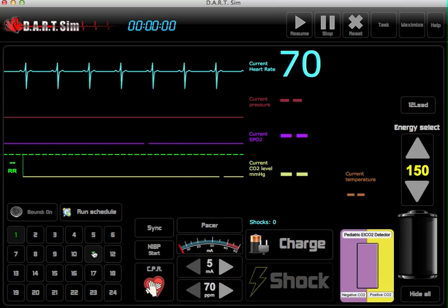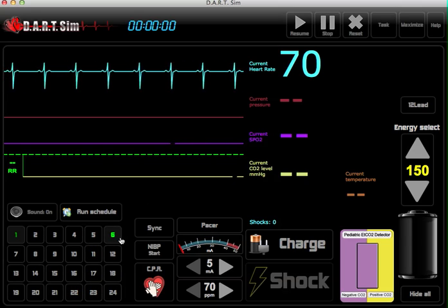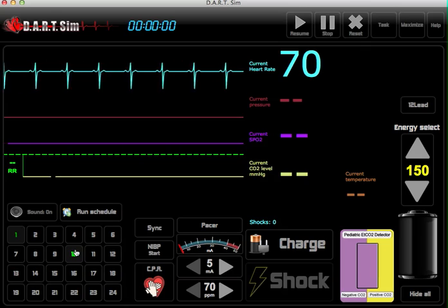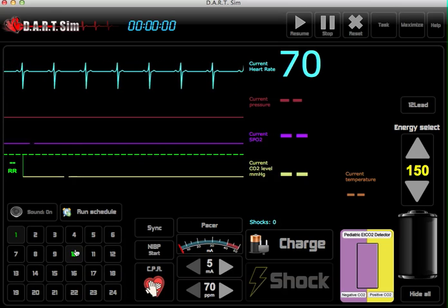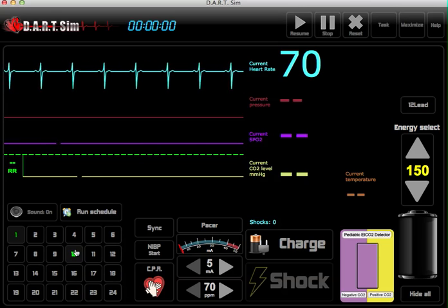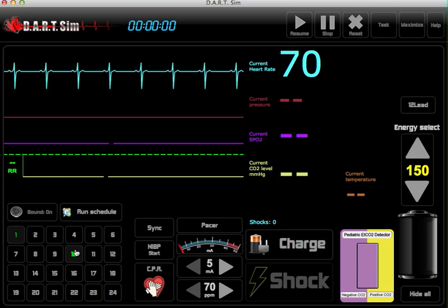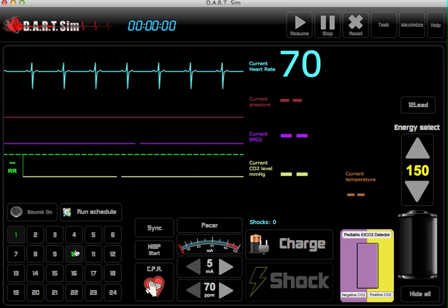You can also change the rhythm by holding down the shift key and entering the desired rhythm number.